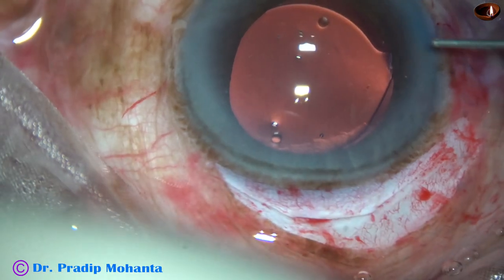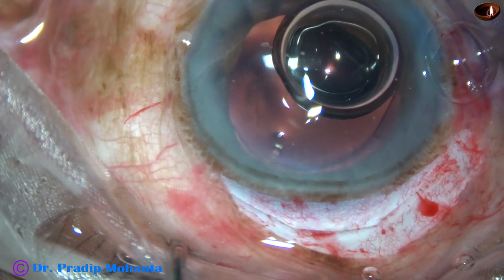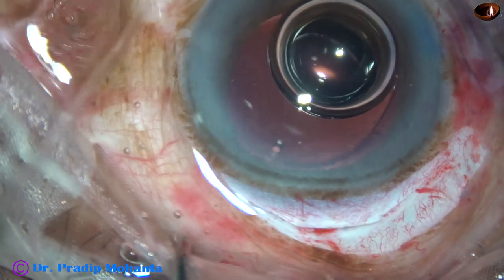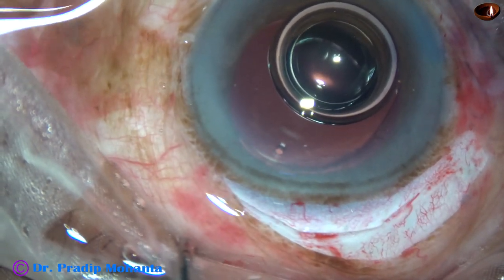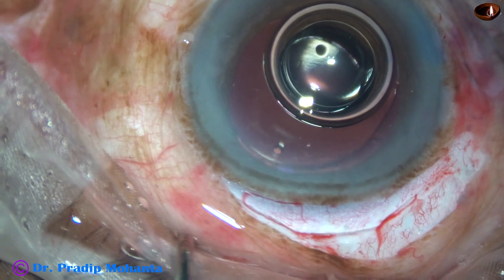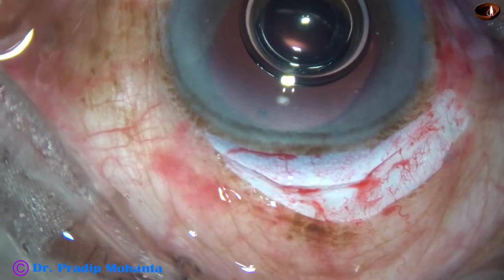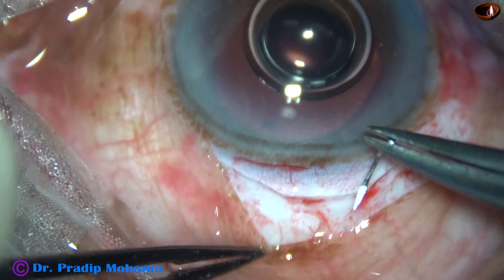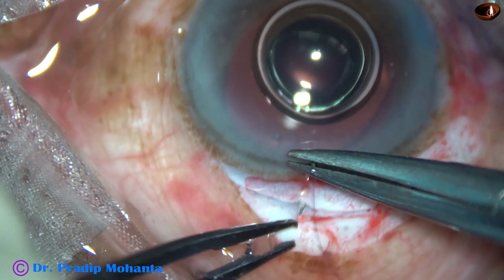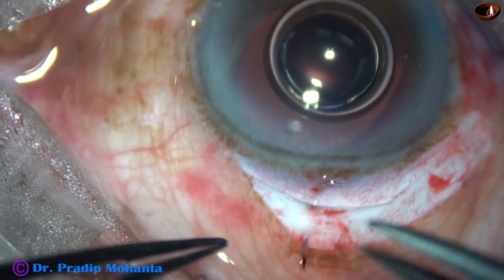And now I inject a small bit of air to raise the intraocular pressure and plan suturing of the wound. I am going to put only two sutures. The central part of the wound has a straight line; on either side it has two arms of a V-shaped line. So I am going to put two sutures at the corners of this — one here and one more at the other side.